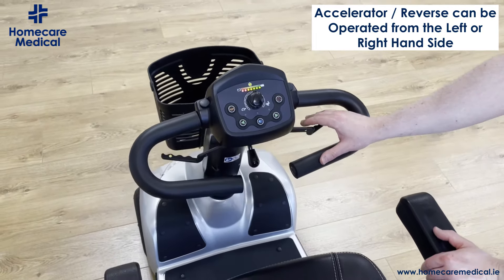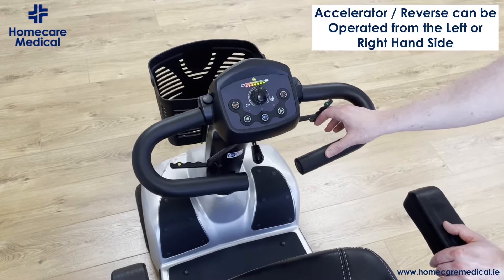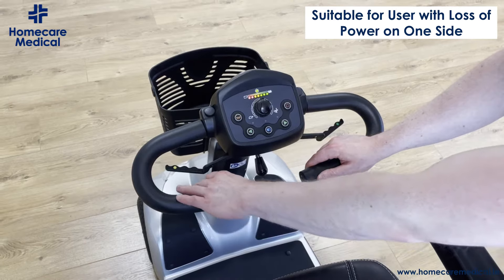To accelerate, you can pull on the handle here on the right towards you and the scooter will start to move forward. To reverse, you simply push away.